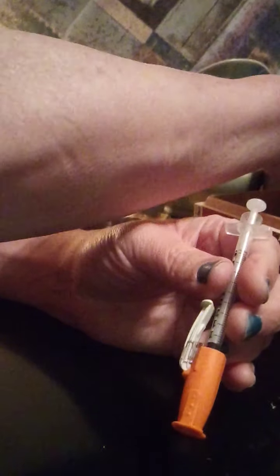But, you know, when I have to shoot up, let me get that syringe back out, with the U100, with this insulin, the U100, that you saw when I was taking the long term, and even the short term at 68, and having to pull this plunger all the way out to the end, that I even pulled the plunger out. So there's a great amount of difficulty in taking insulin where you have to pull the plunger out almost to the end.